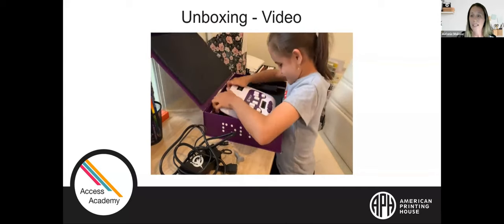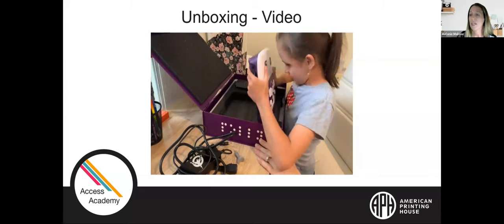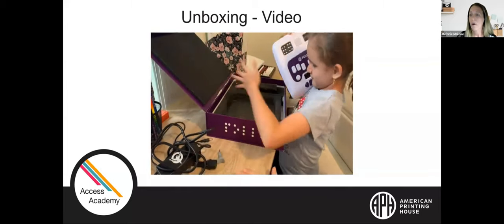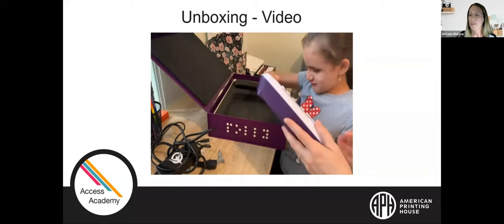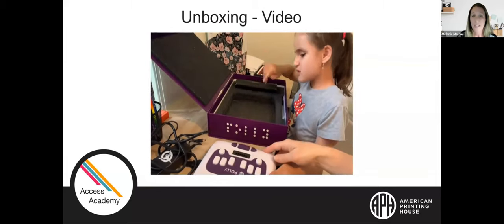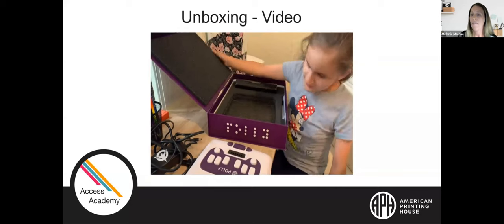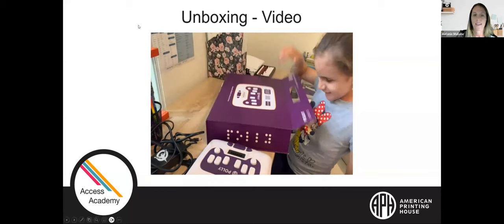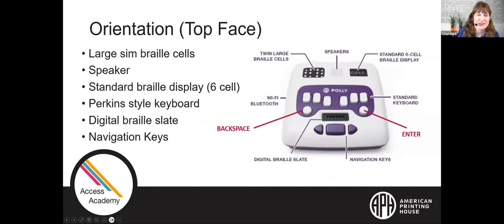She's going back into that smaller box and found the stylus. She's exploring the stylus with both hands and saying that it reminds her of a Braille eraser. She put the stylus to the left next to the power adapter on the table. The last thing in the box is the Polly itself. She is using two hands to take it out carefully, putting it down on the table and closing the box. She's so excited about her new Polly and can't wait to start using it.